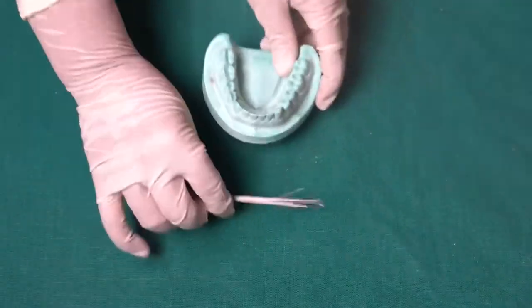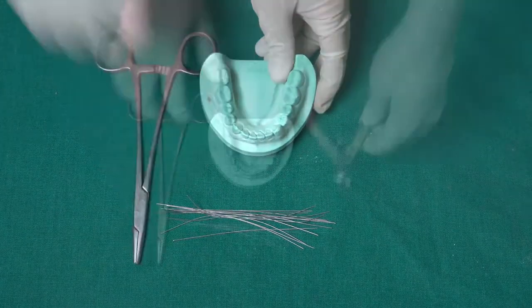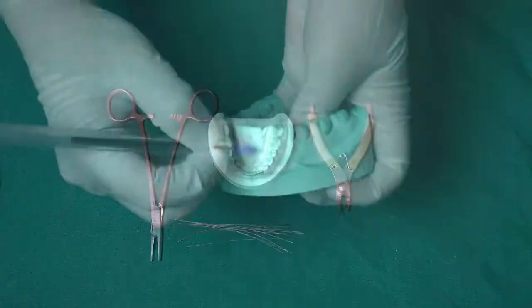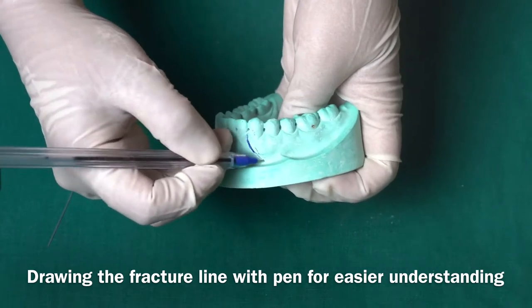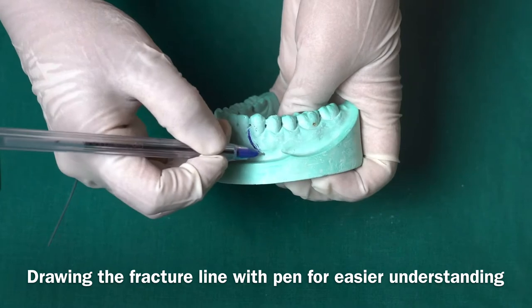Firstly, we will require a cast, then a 26 gauge wire, then a twister, and then a cutter. I'll draw with a pen here to mark the fracture line so that it will be easier for you to understand.